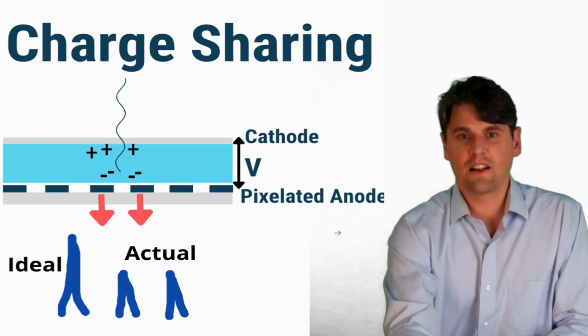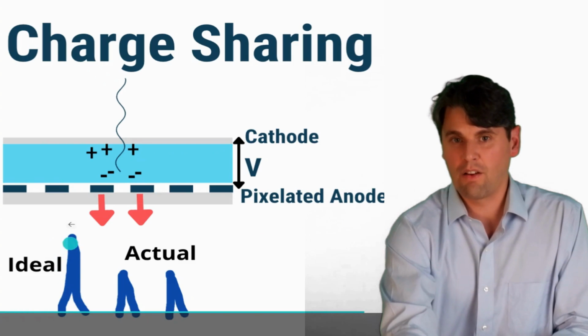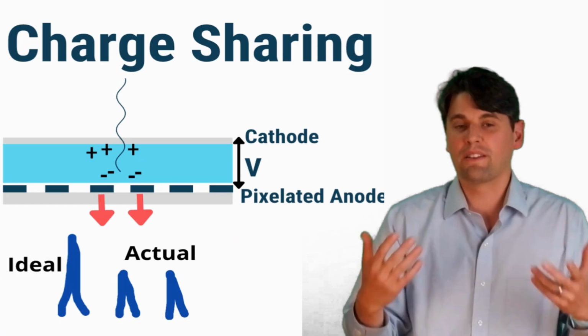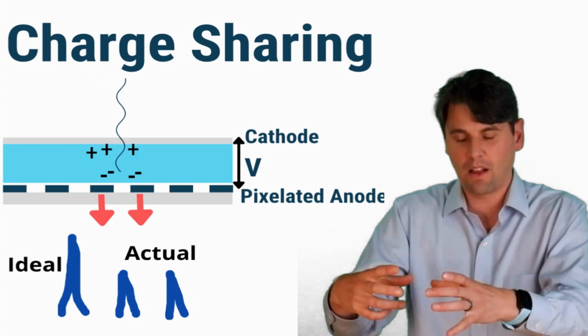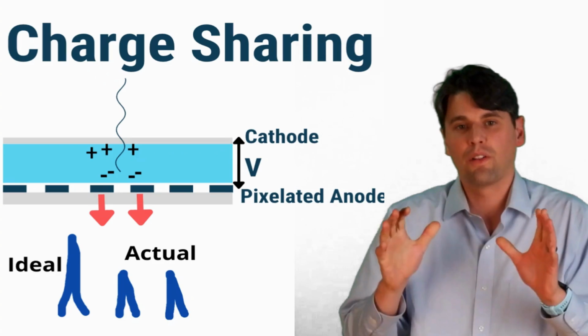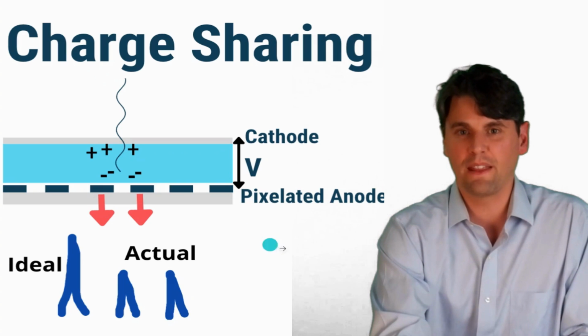And the idea here is that you have an ideal signal, which would be measured here from your X-ray, but in actuality, you're going to get multiple signals. And I'm just showing two here for these two neighbors, but you can think of even four neighbors in the 2 dimensions. So this is the case where the signals split equally if it landed right in between the two.